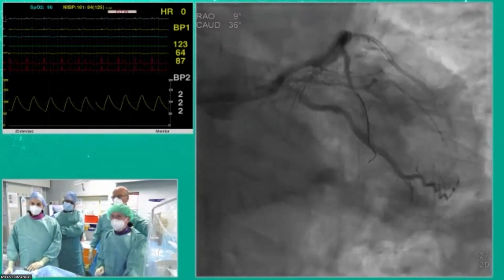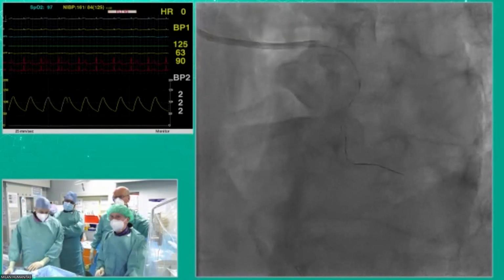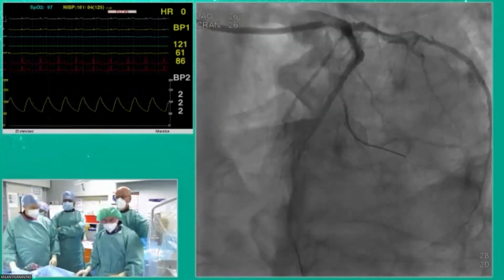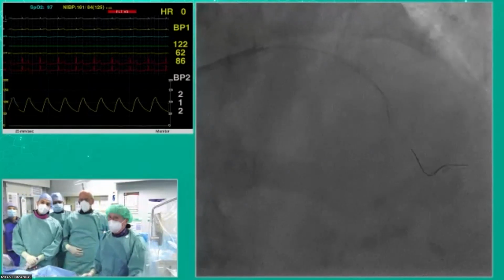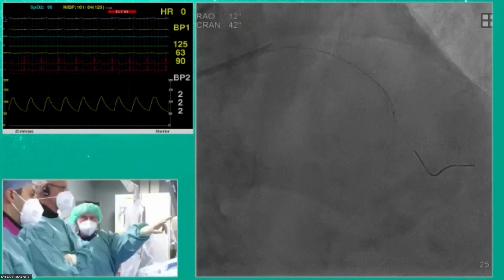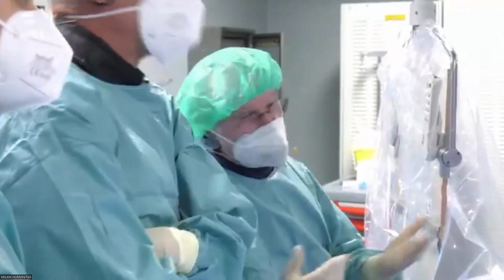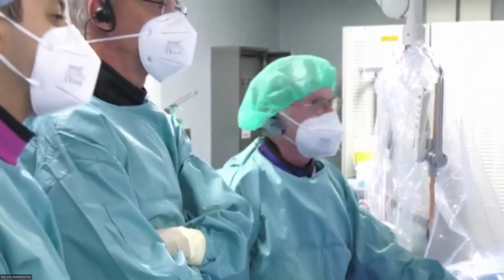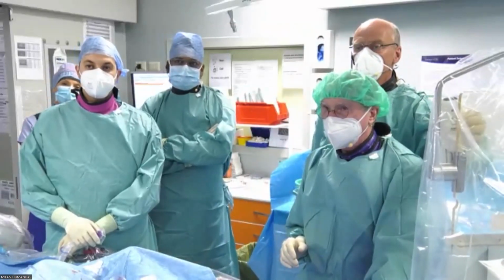So, can I ask a question? Yeah, Sushil, go ahead. Hey, Antonio, Sushil. I've been watching, and we all learn, but you have thousands and thousands of procedures behind you. People in the audience don't have that experience. I'm not arguing against placing or not placing a stent proximally. If you do a randomized study in those types of lesions to show a benefit of a DCB, you need a thousand patients, because stents are working well. So you do whatever you like. My question is, for your junior colleague who is one to two years out, do they not do this case? If they end up doing this case, do you tell them to err on the side of stenting?